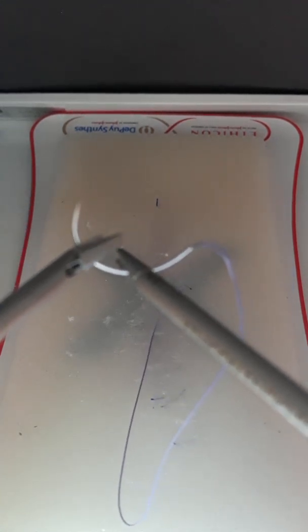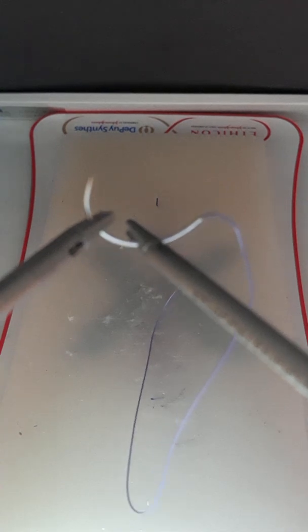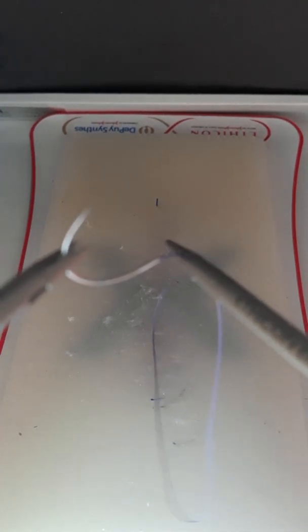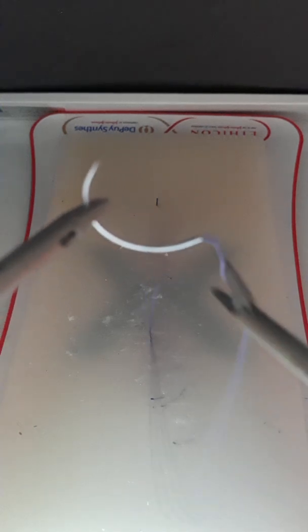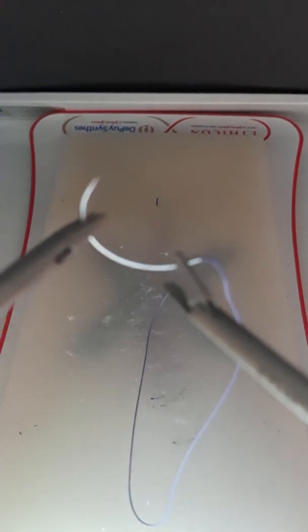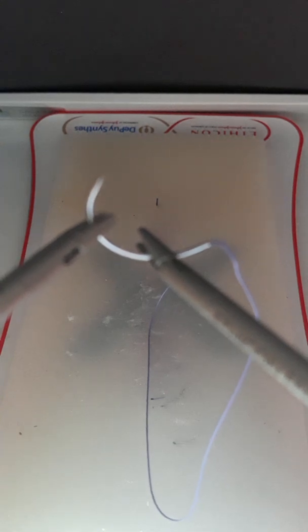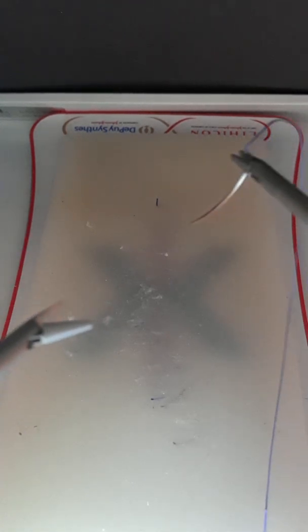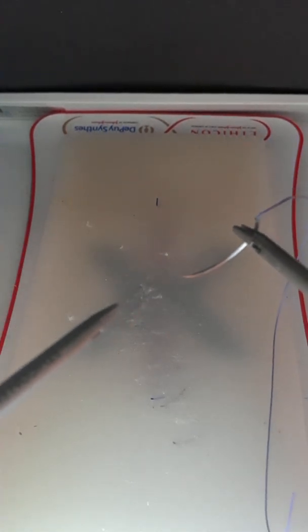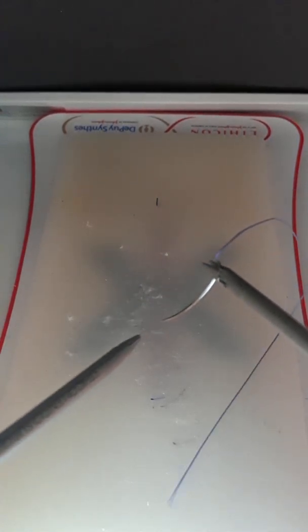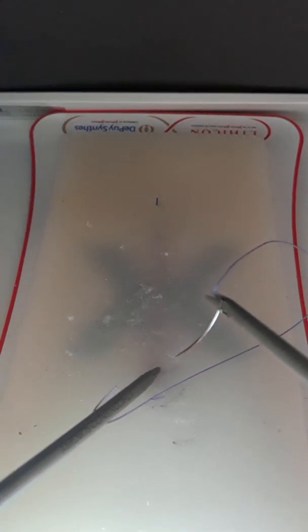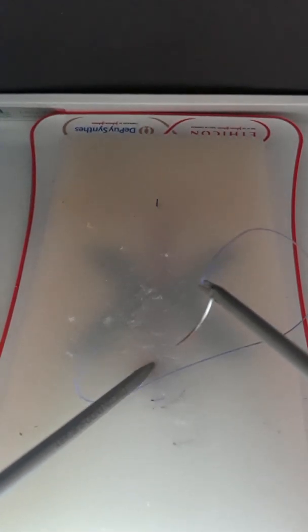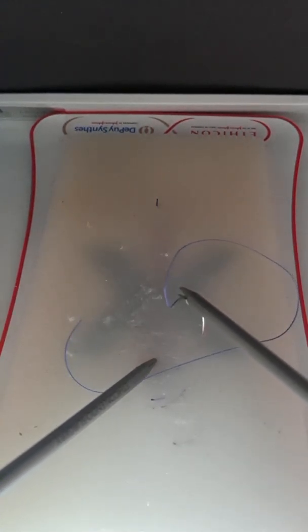I'm going to do something I was taught recently in a course by Dr. O'Hanlon, who basically engraved this in my brain: grab the needle with the molars of the needle holder. Now that I have it, I'm going to give myself a haptic feedback reference by touching slightly the tissue I'm going to suture, then go in parallel.